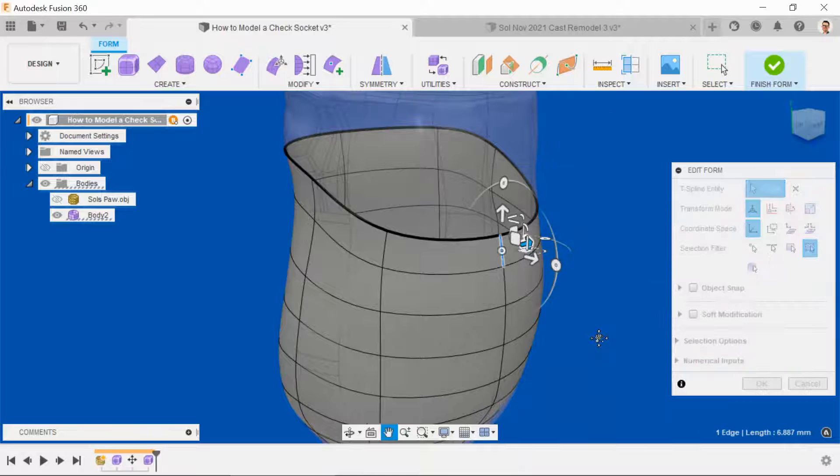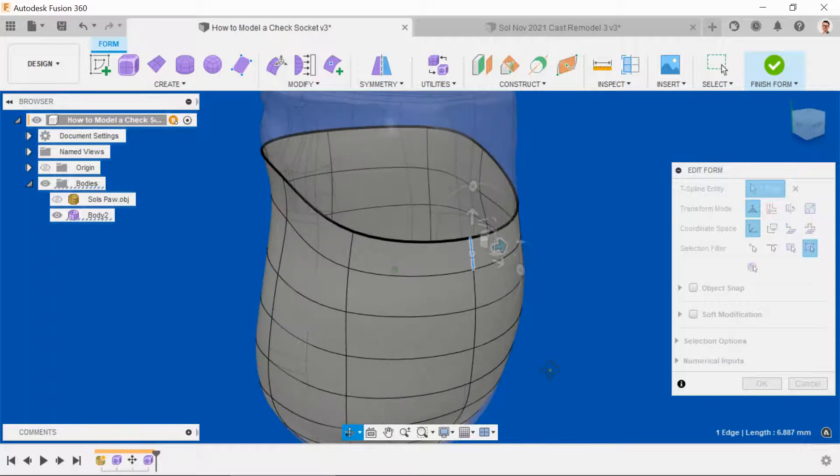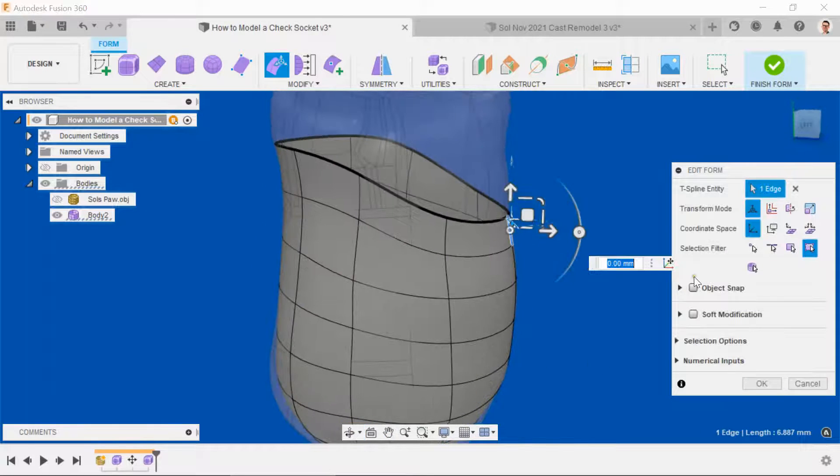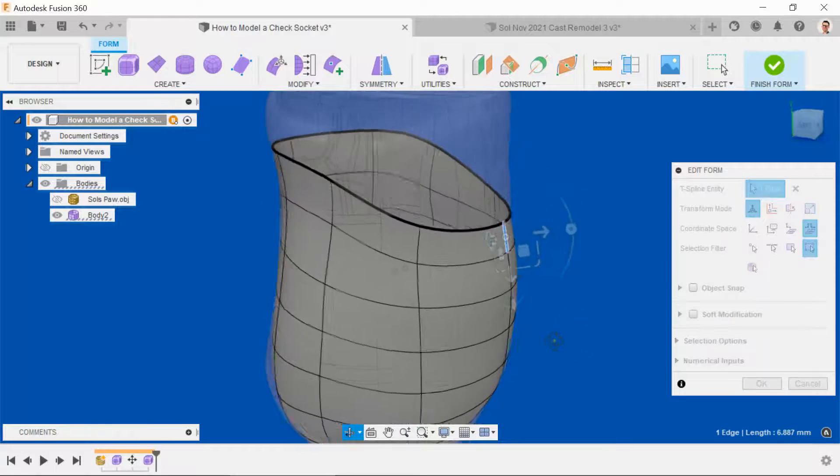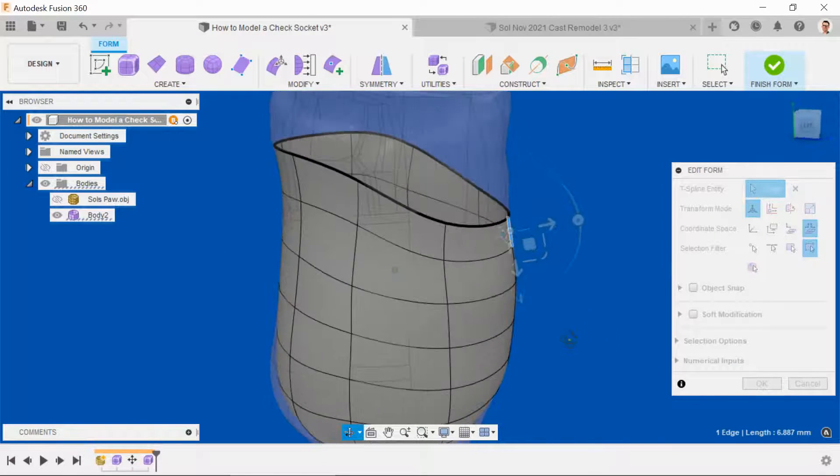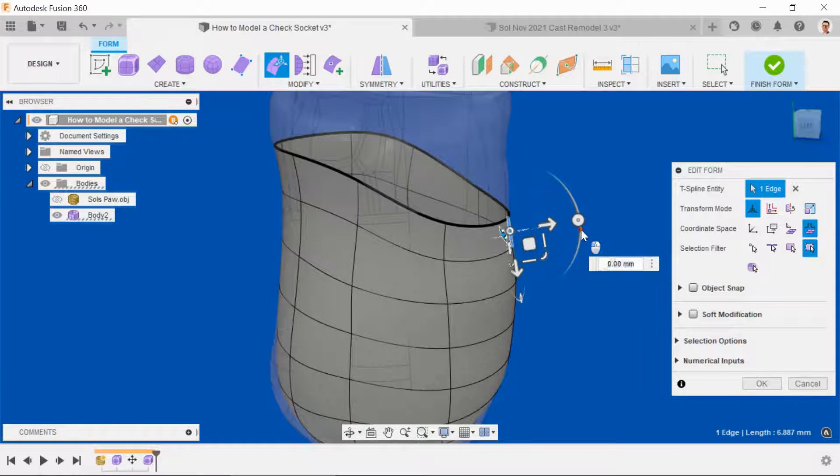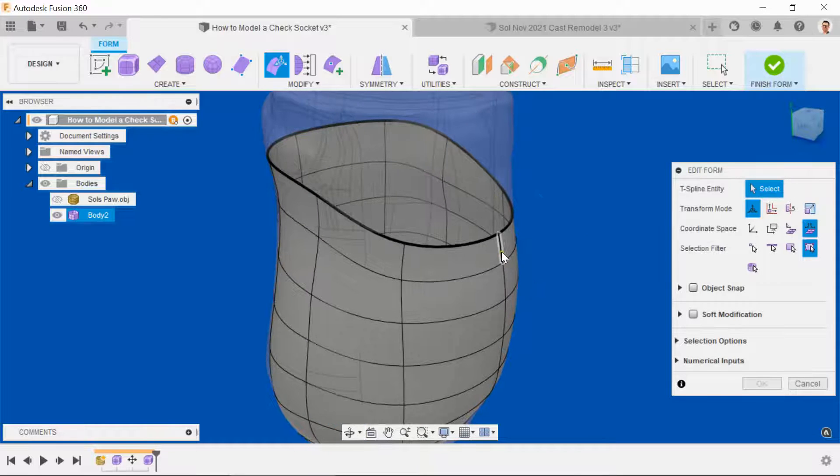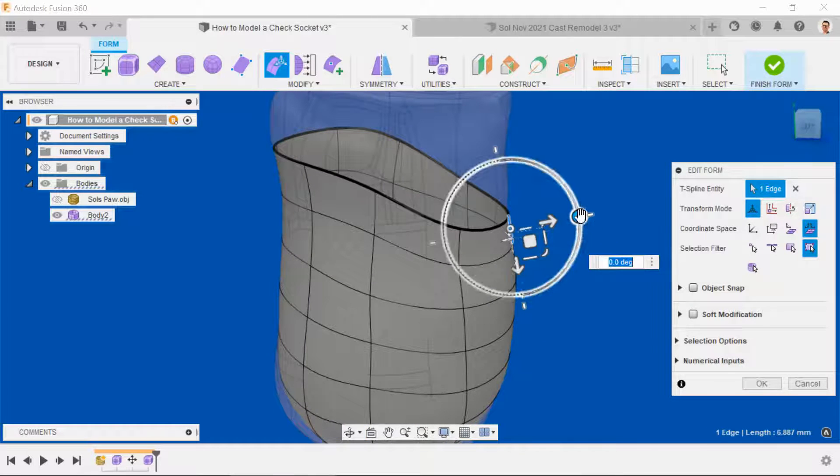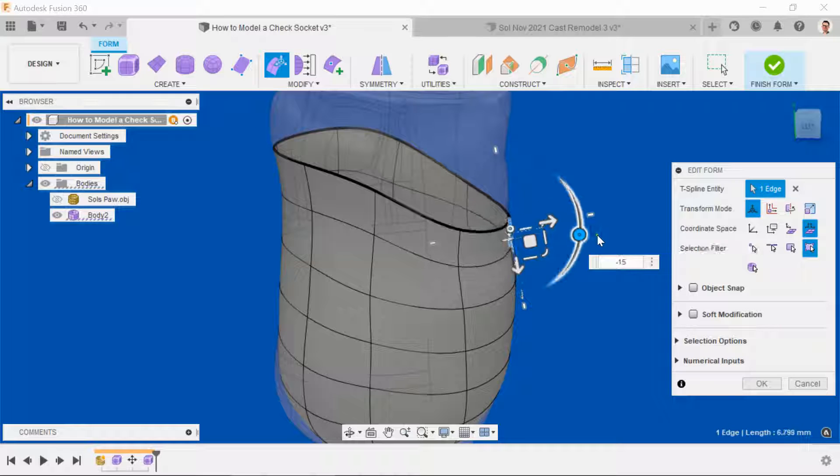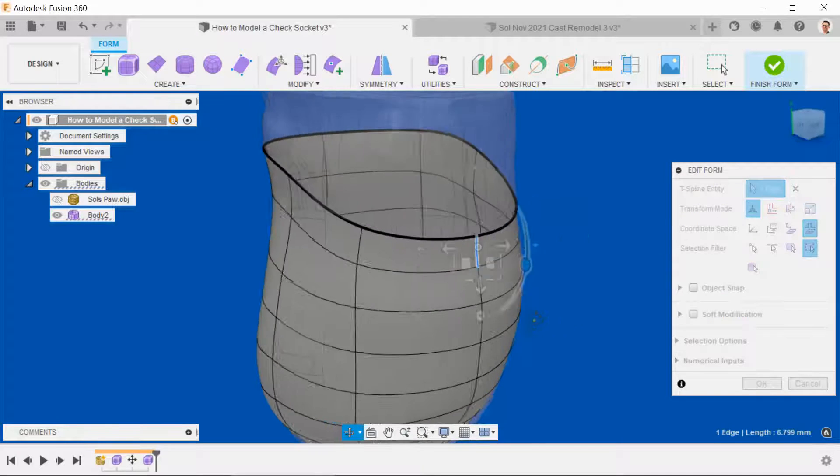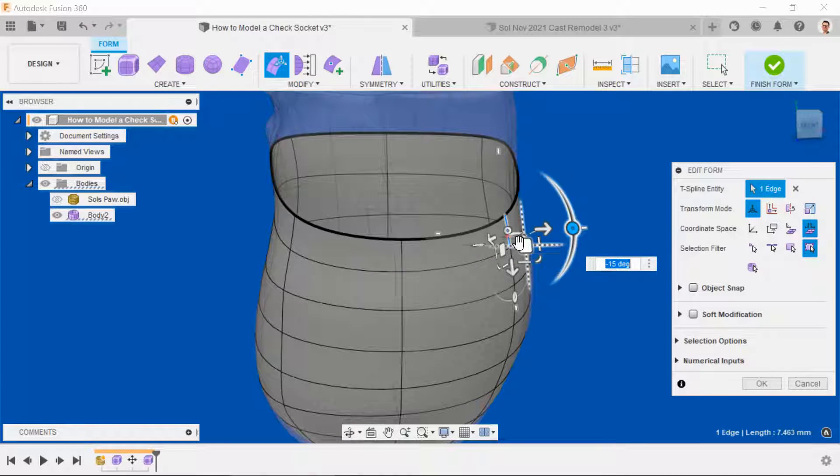And then we'll introduce the flare. So in the Edit Form window, you want to select local per entity. And we're going to use the outer scroll wheel to make sure that each one of these upper splines is rotated out 15 degrees. And we'll do the same all the way around.